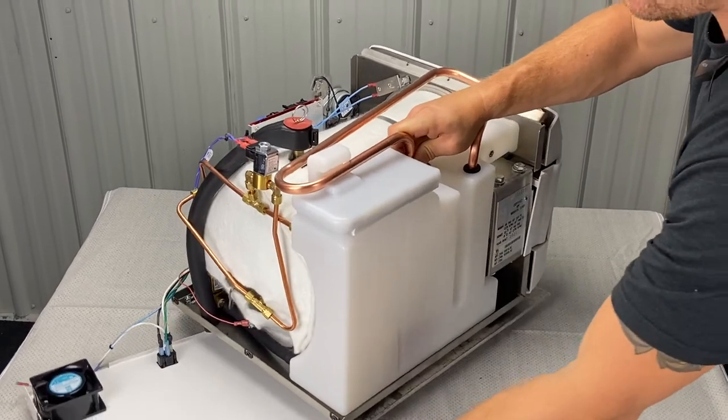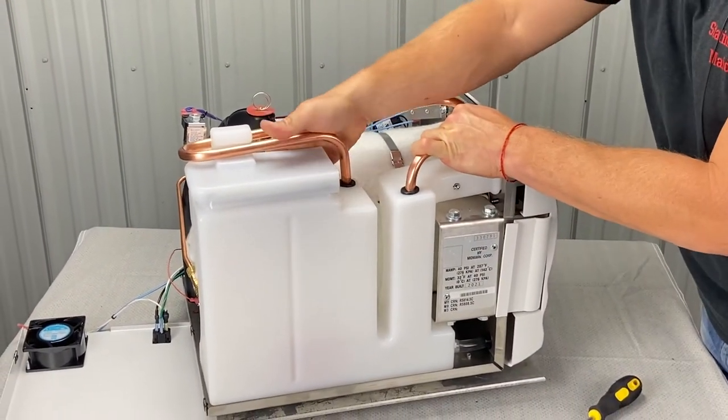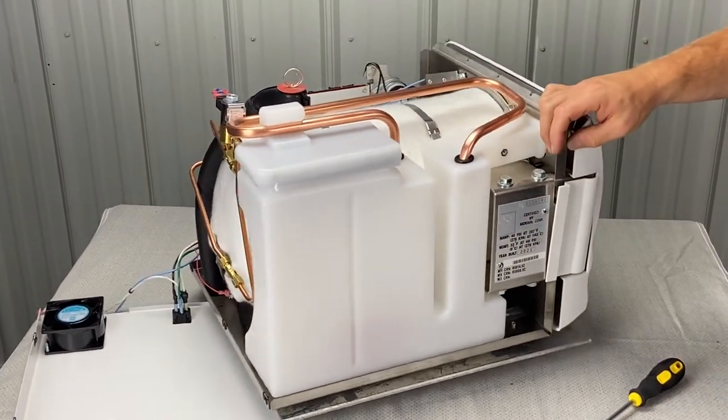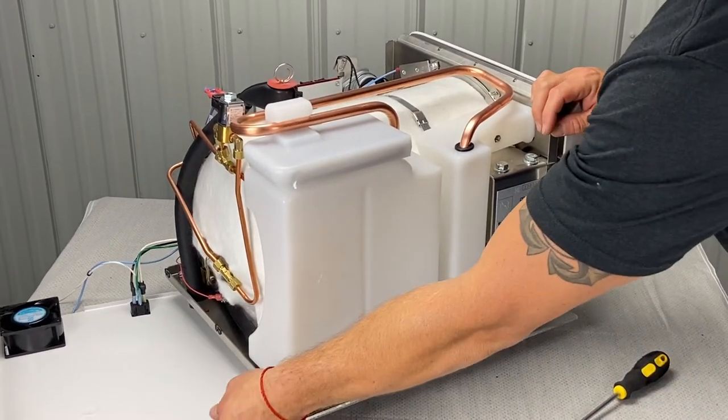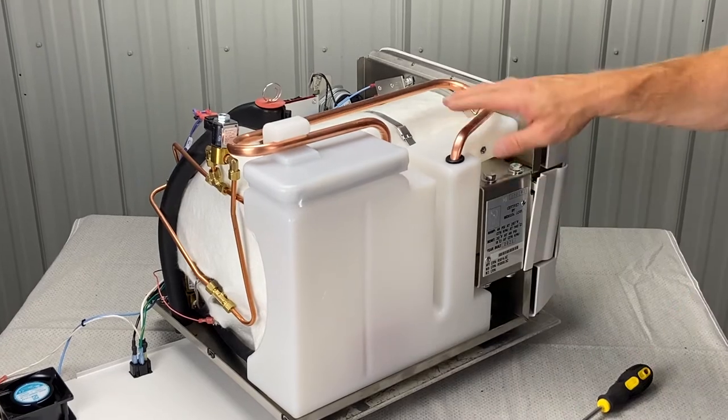I got this all set up — I left the panel hooked up. One's in, I'm manipulating it to get the other one in. If you push too hard, you can push the rubber grommet in. It's not the end of the world, but just annoying. Then we got the copper tubing on.